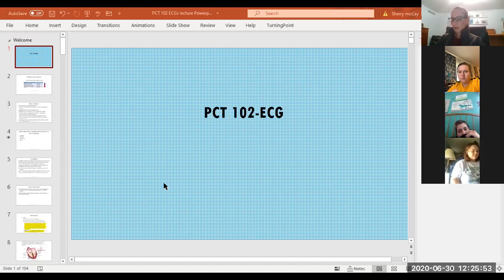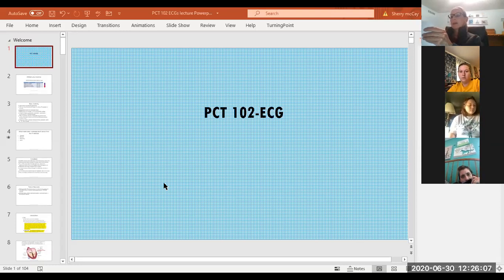When you are working with the paper of the EKG, you're going to thread the paper through the roller to the outside of the machine. And I already said this one, make sure you tell them to empty their bladder before you start the EKG. So if somebody has left ventricular heart failure, you would see pulmonary edema. A normal EKG pattern is as follows: a positive P wave, negative Q wave, positive R wave, negative S wave, and a positive T wave.